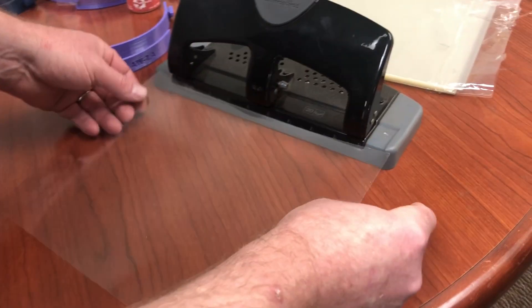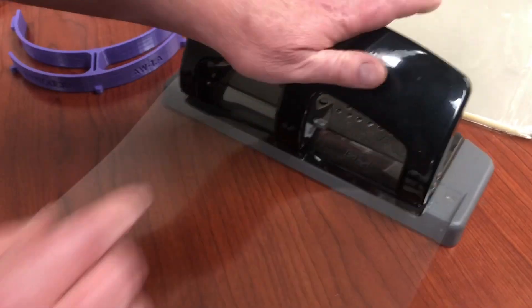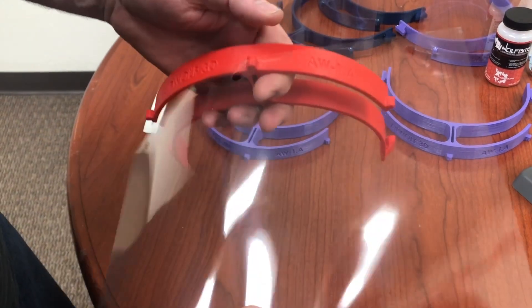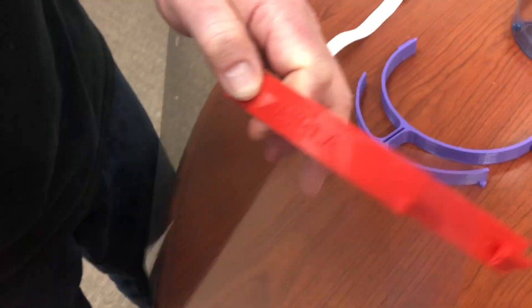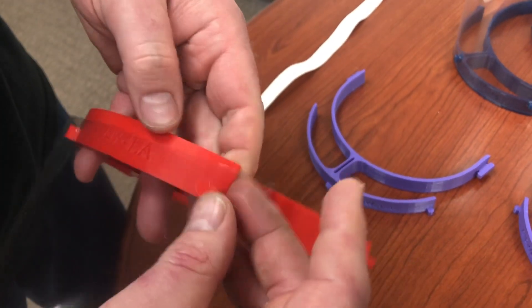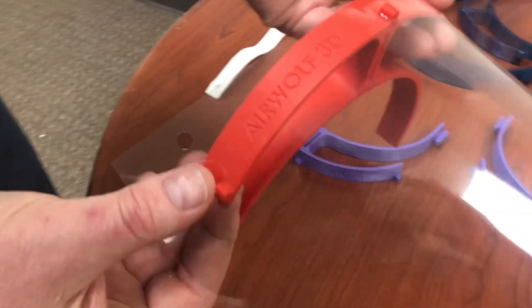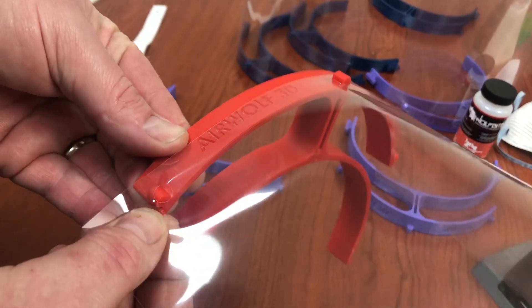I've got my eight and a half by 11 transparency. I'll put it in my three-hole punch right there. Then we're going to start it on our plastic 3D printed face shield. The studs on the face shield correspond with the holes that we've made in the transparency.